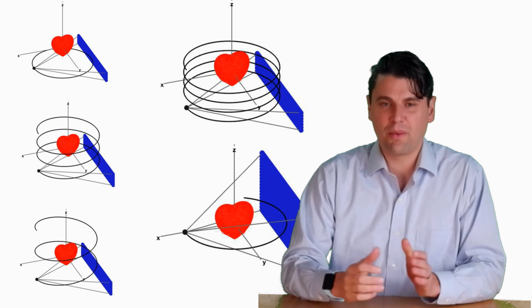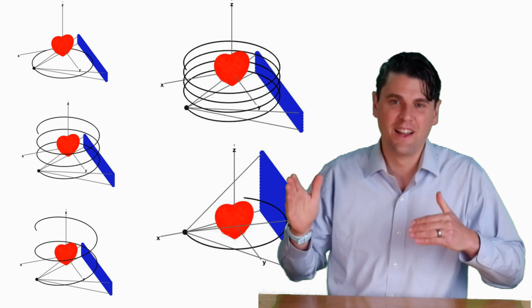Again, all these images, just to make it simpler, I've shown here a flat panel detector. In reality, on a modern CT system, it's going to be an arc or a curved detector. Now you know about the different scan modes, but in order to know the details of third generation CT scanning, that's the basis of this acquisition, check out our video on third generation CT coming up.